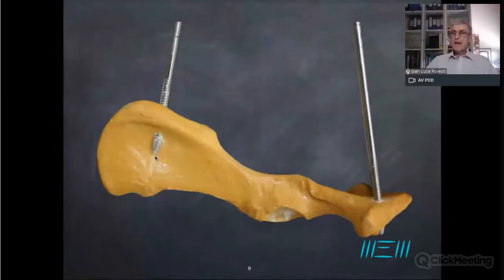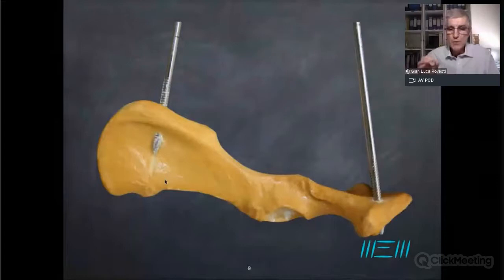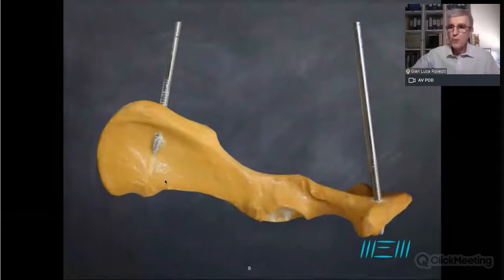Why? Because trocar tip is not suited to cut the bone, so the quality of the thread will be very poor. I want to insert threaded pins that I will insert exactly as an orthopedic screw. So pre-drilling, and then I will thread the pin in a way that I will get the best possible thread quality.